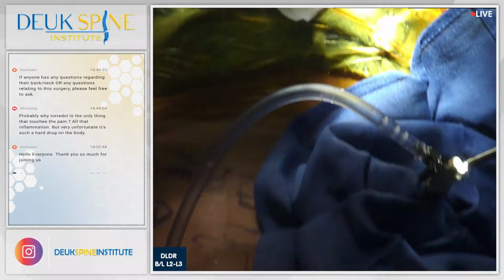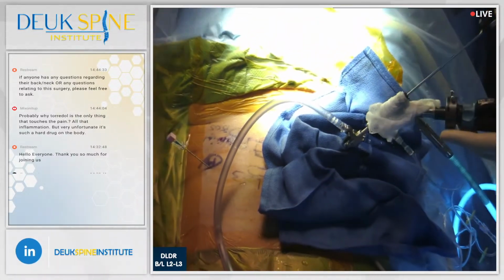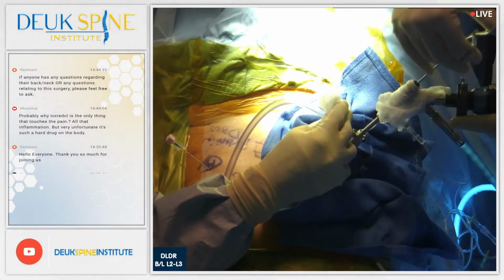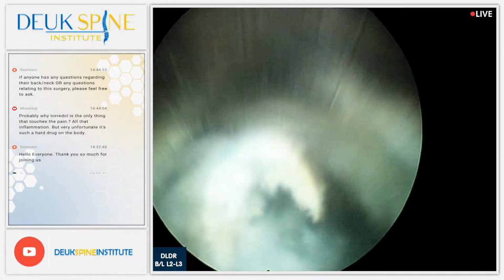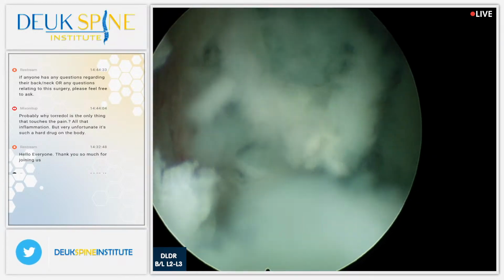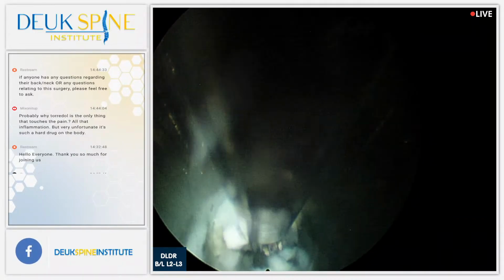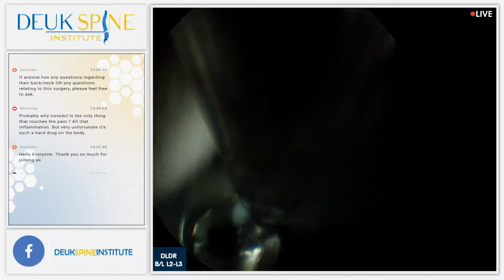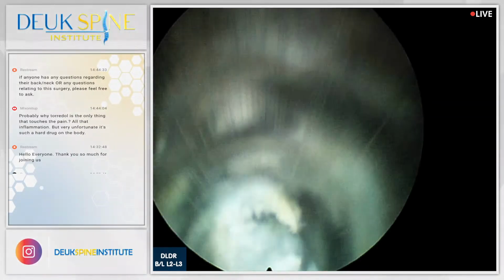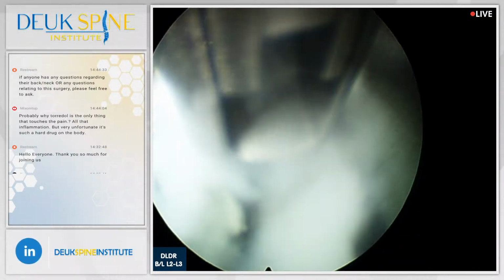We've had about 8 of them now come out of this one disc on the same side, left side. And there's more pieces, right? So, you know, herniated disc, a lot of people think it's one piece. It's not. A herniated disc is multiple events that happen over time, and they all begin with trauma. Trauma to the disc. And what causes that trauma? It could be a sports injury. It could be a fall. It could be a car accident. And it's always traumatic that causes a tear in the disc.